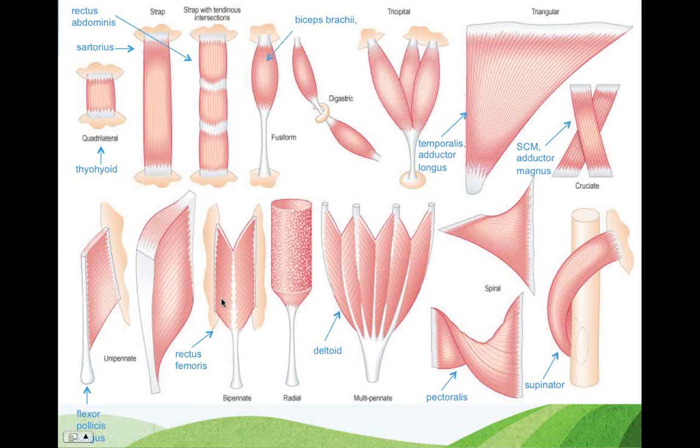It's all really beautifully planned out, the way it's organized. So it's really important to get to know, because these orientations all change what the muscle looks like on the ultrasound. And here you can see in a bipennate muscle, you'll see a nice little fascial plane right here in the center, and then some fascia here on the sides. This gets to be really important in diseases that affect the extracellular matrix in muscle, and I'll show you some pictures. But this ends up being called the central fascia of the rectus femoris muscle.